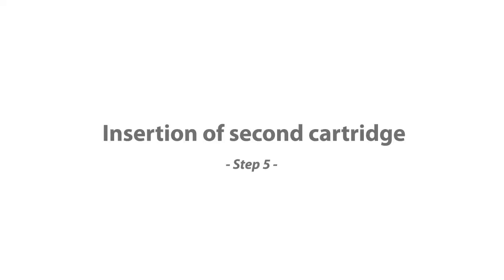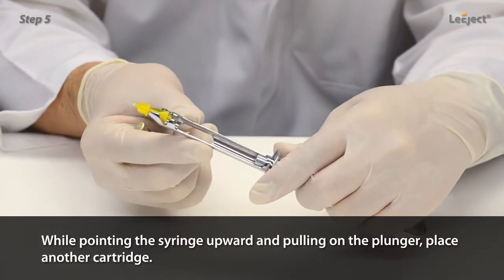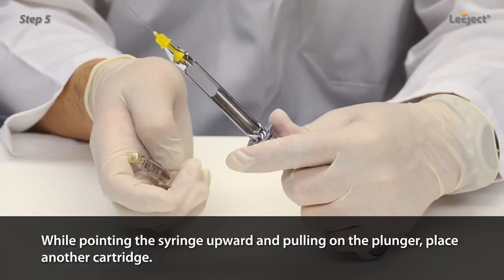Insertion of second cartridge: while pointing the syringe upward and pulling on the plunger, place another cartridge.